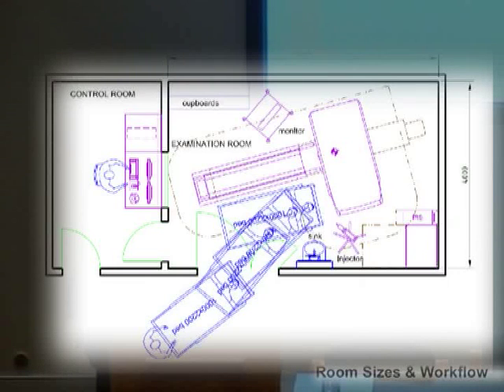The bed, for instance, is a normal hospital bed size. Now to get that into the room, we're going to have to rotate the smaller of the double doors back further than the 90 degrees that is relatively standard, obviously trying to avoid hitting the sink as you rotate that back. Once the bed is in position, then we've got a problem with the positioning of the sink and the clinical staff to transfer the patient from one bed to the CT table.